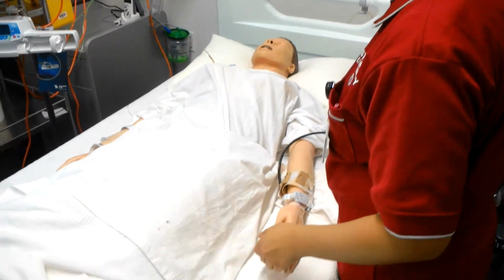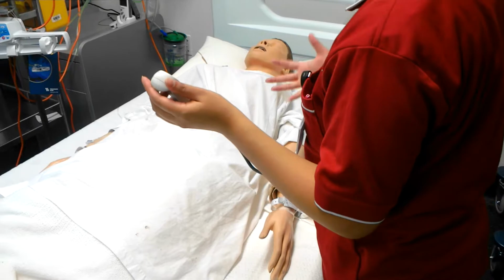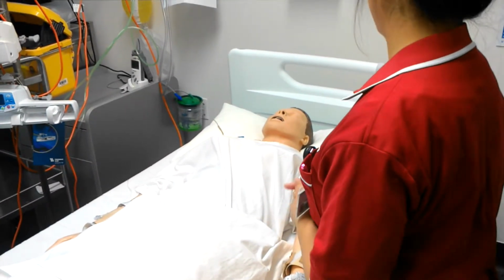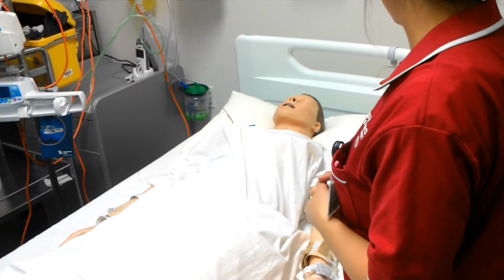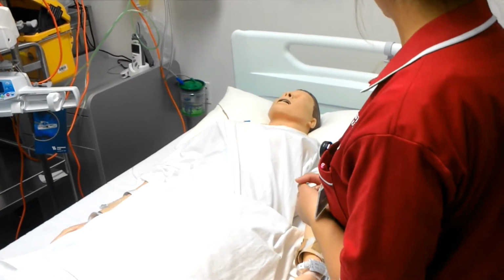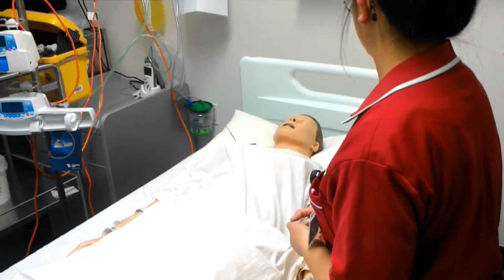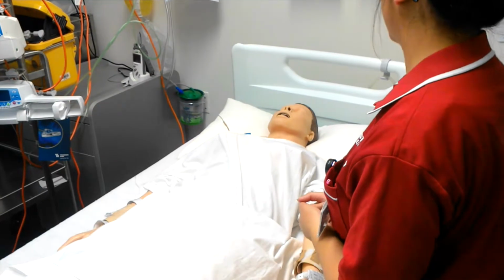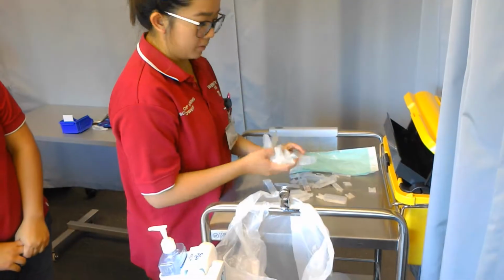So at the moment it is solid green. Okay, so now it's blinking, so that means the medication is going through. I'll come back in 15 minutes or so to do another set of obs, so we can monitor how you're going as well, just in case any side effects do occur. We do have medication that can help you. So if you do have any dizziness or headaches, just please let me know. So I'll leave you with the nurse's buzzer as well. So just give that a press if you do need any other assistance. All right. Discard my equipment.